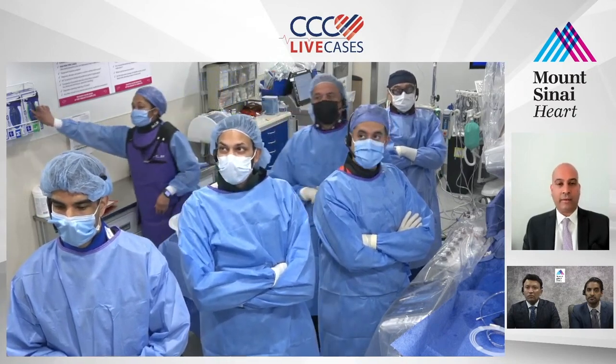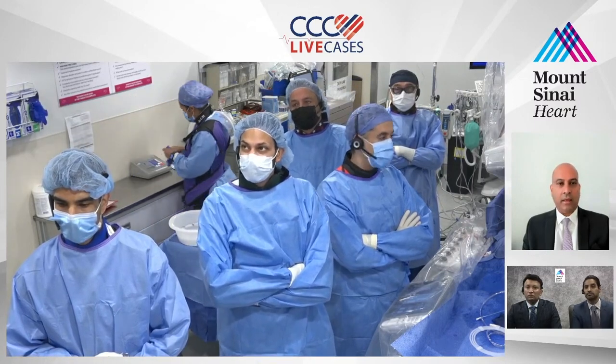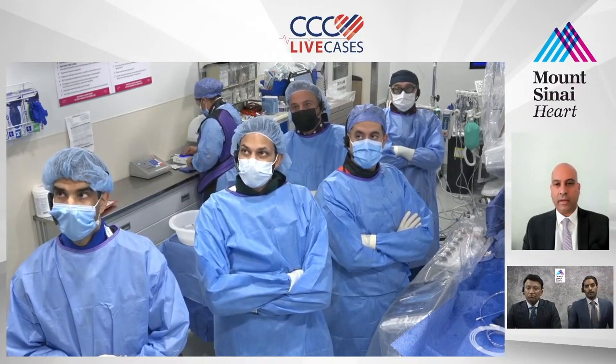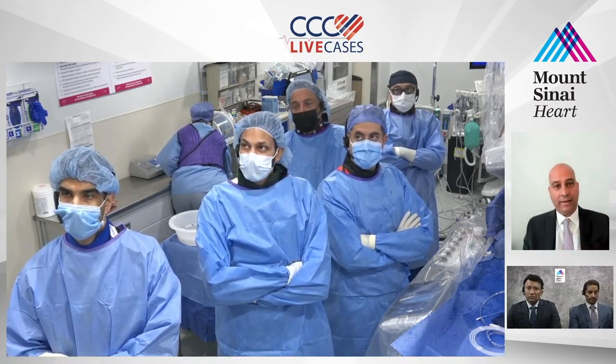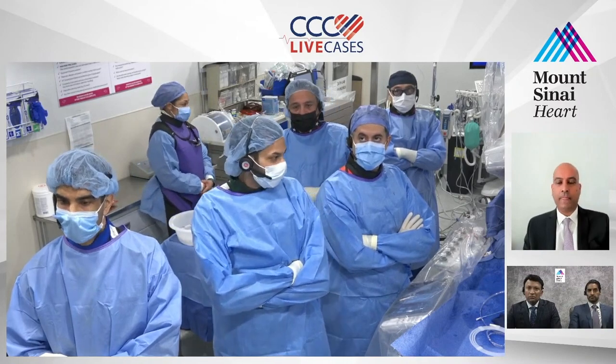The question is, do you access that single vessel runoff, I think I saw a single vessel, or do you try to access one of the occluded diseased arteries that's really not a good runoff vessel? Then there's the larger sheath and so forth, especially if you can treat that CFA, you're going to need at least a 6-French sheath. Ajit, what do you think?